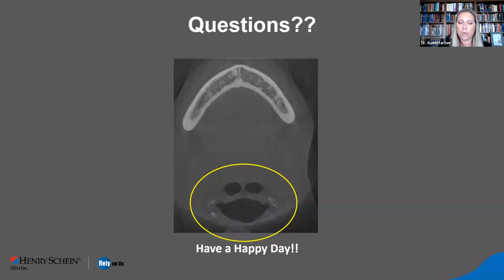And again, the malpractice attorneys are the ones that are telling us that it's too expensive for them to defend that dentist if all they have is that 2D imaging, and there wasn't a CBCT taken for pre-implant planning purposes. So ideally, it's smart to take a CBCT.